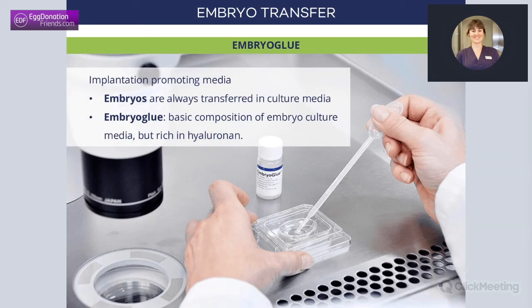So finally, I'm just going to speak about one more technique, which is related to embryo transfer. Embryos are always transferred with some culture media, and embryo glue is basically a media which is rich in hyaluronic acid. So this makes the media a little bit more viscous, and the idea is that it will help the embryo stick to the endometrium.